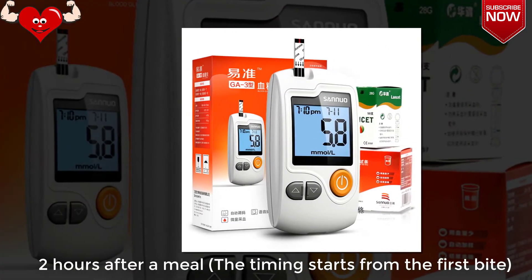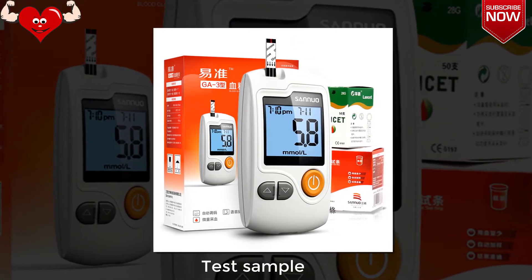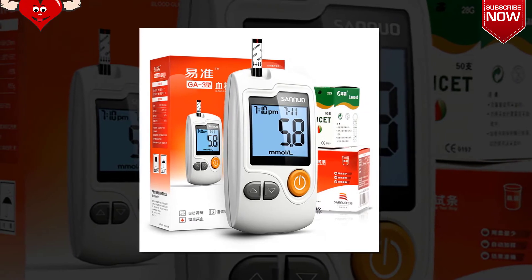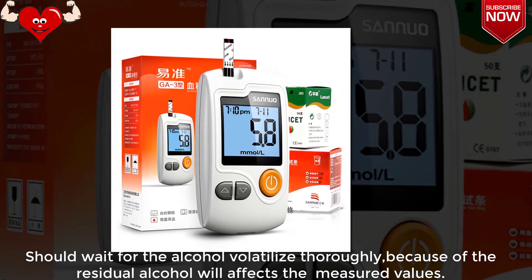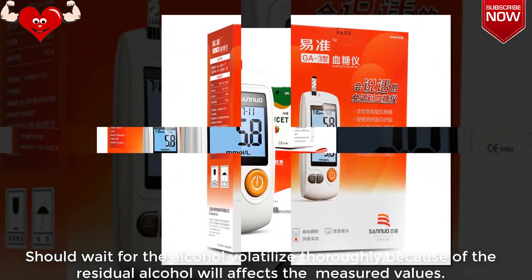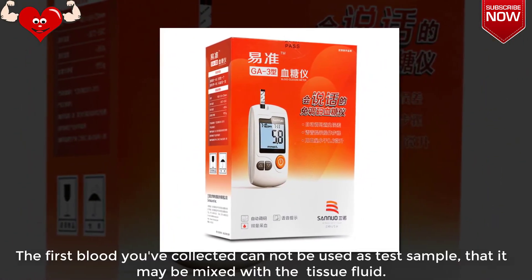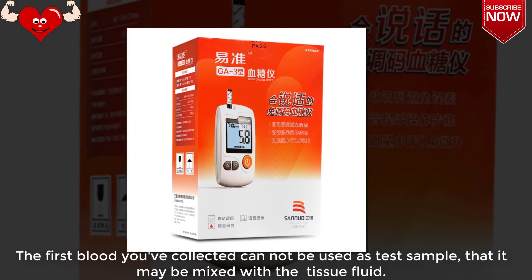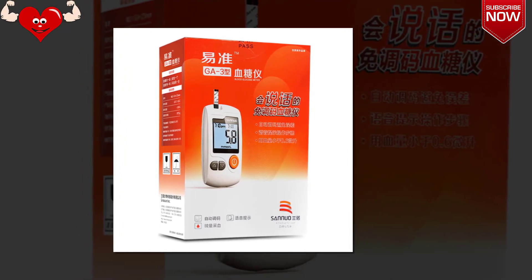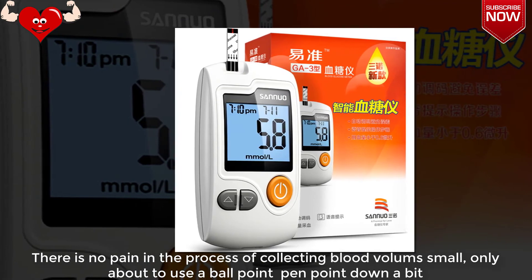Two hours after a meal, the timing starts from the first bite. The test sample should wait for the alcohol to volatilize thoroughly, because residual alcohol will affect the measured values. The first blood you collect cannot be used as a test sample, as it may be mixed with tissue fluid.